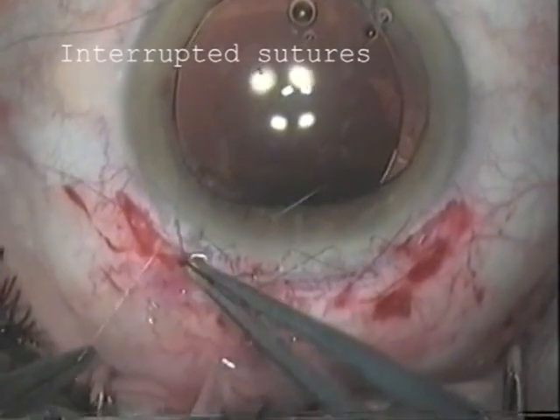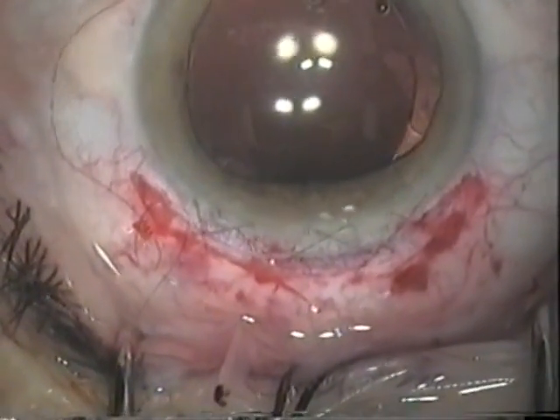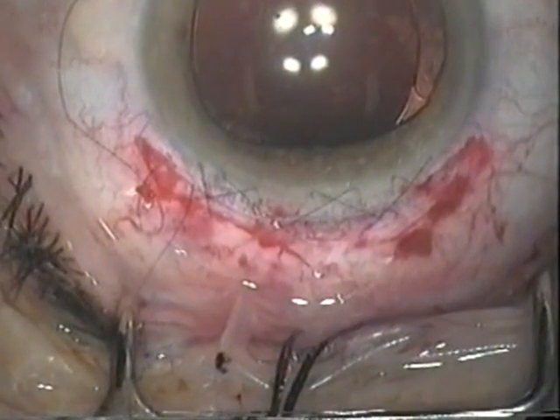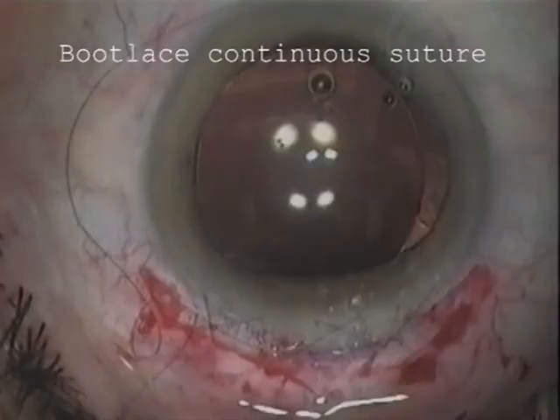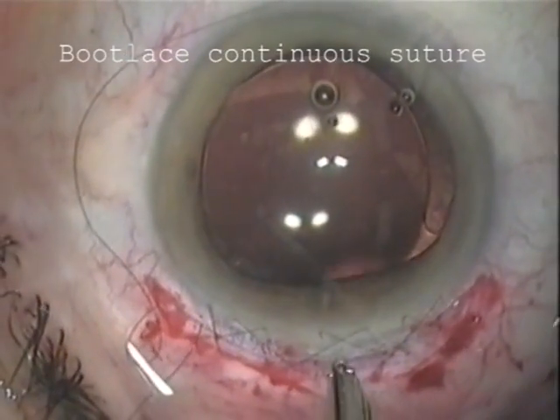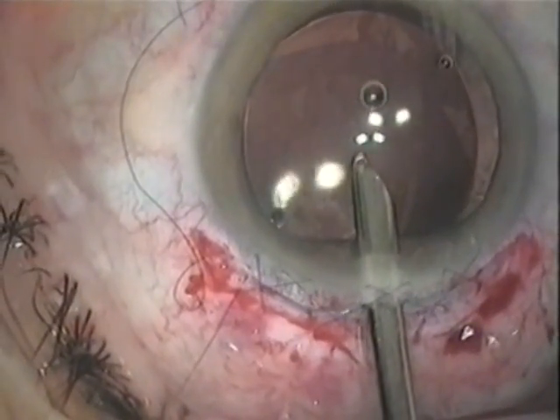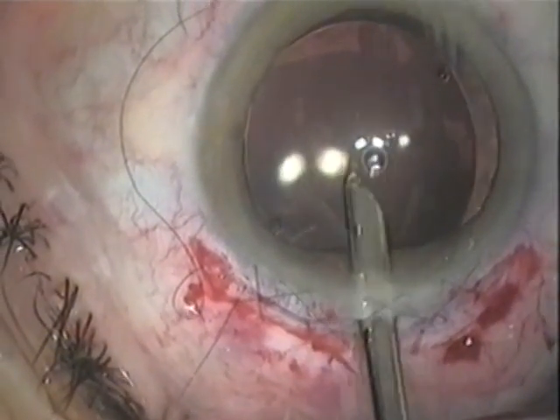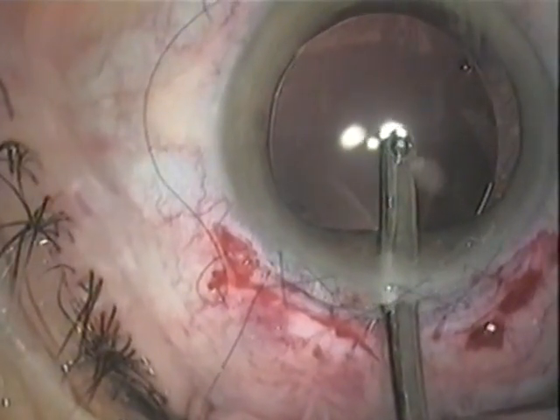As an alternative, a continuous boot lace suture as previously described in the suturing section of this DVD can be placed to close the wound. Between the sutures, a Simcoe cannula is inserted in order to wash out thoroughly all the viscoelastic and remaining cortical lens matter.